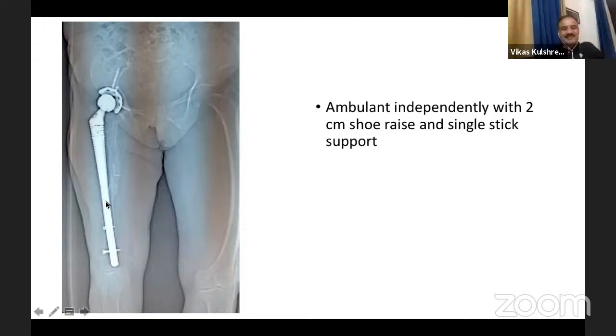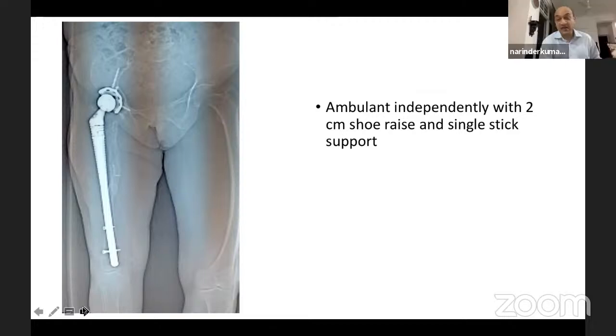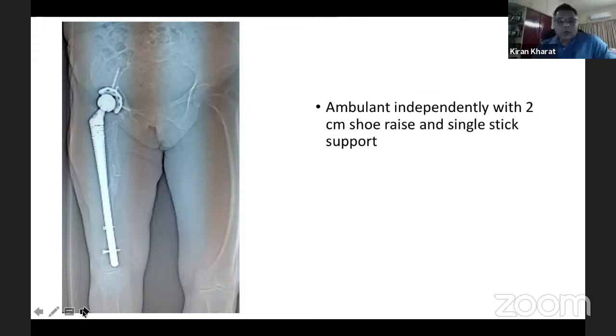Okay, I think very well done. Good case, and it illustrated very well the points discussed. Reef is a real bailout stem for these. Yeah, lately people are going towards cemented a lot, but this is one uncemented stem. With this kind of bone stock left, I think it should be used. Because of its coating, it integrates very well. Once I tried to remove this at 3 months, and we couldn't remove the stem. It was so well integrated. Yeah, it is fully coated.